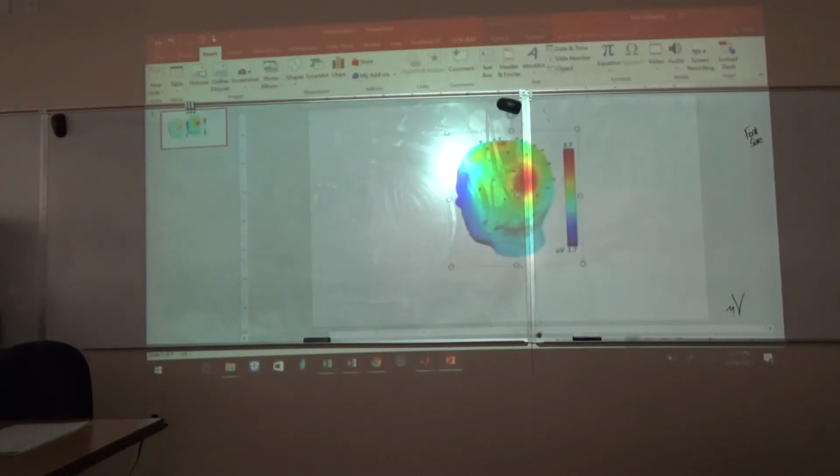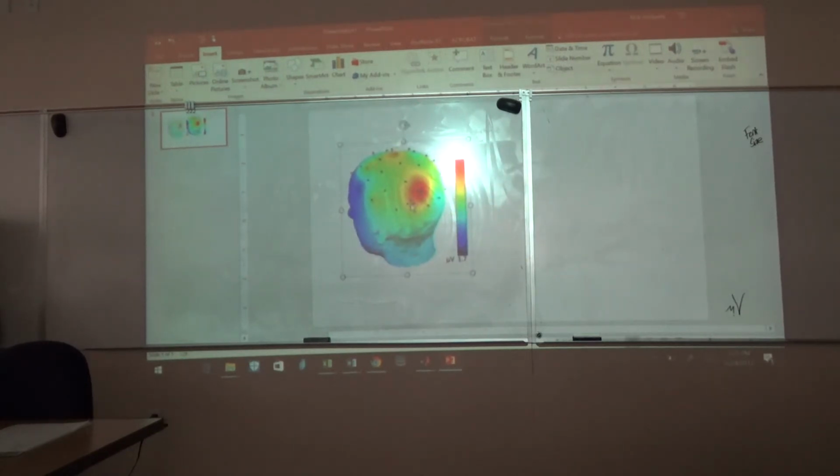And that's it. Pretty nifty, right? Oh, I forgot to do something, didn't I? The latency. Latency and condition. I'm going to hit Control Z and undo my grouping, put in those extra elements, and then we'll regroup it. Sound good?